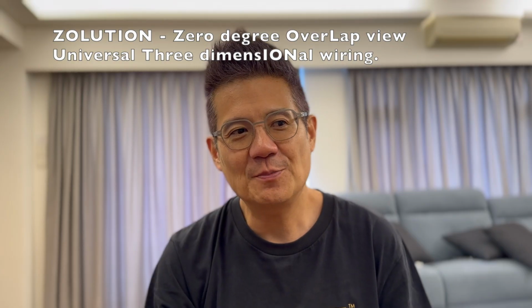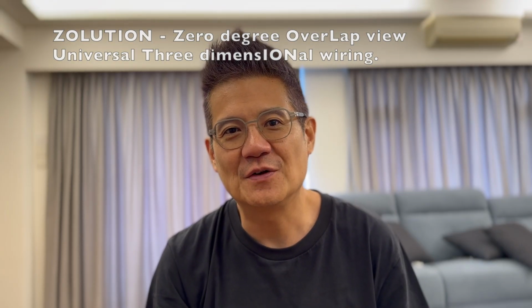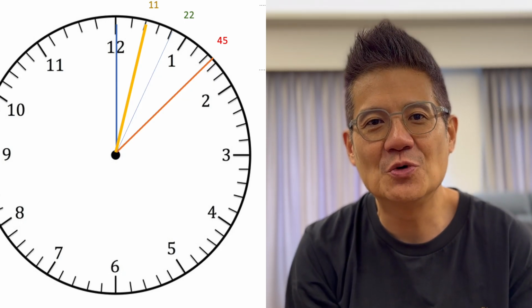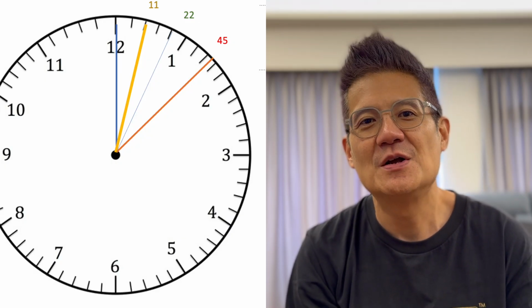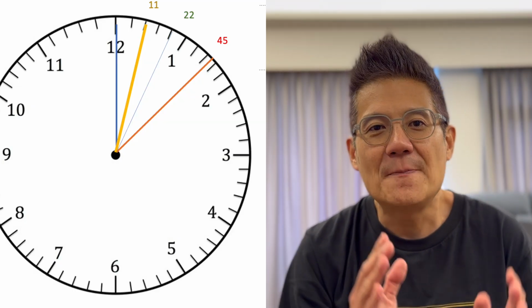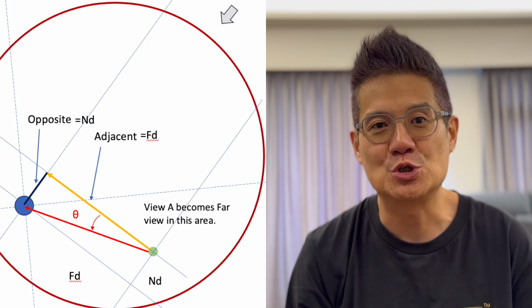First, I want to talk about how I came to this concept of 0-degree overlap. And it comes really from adapt wiring. You can say there's an evolution from adapt wiring towards Zolution wiring. In adapt wiring, you remember, we have to turn the wire tip very small degrees, 14 degrees, 27 degrees, 37 degrees, or 44 degrees, dependent upon the near view divided by the far view ratio.